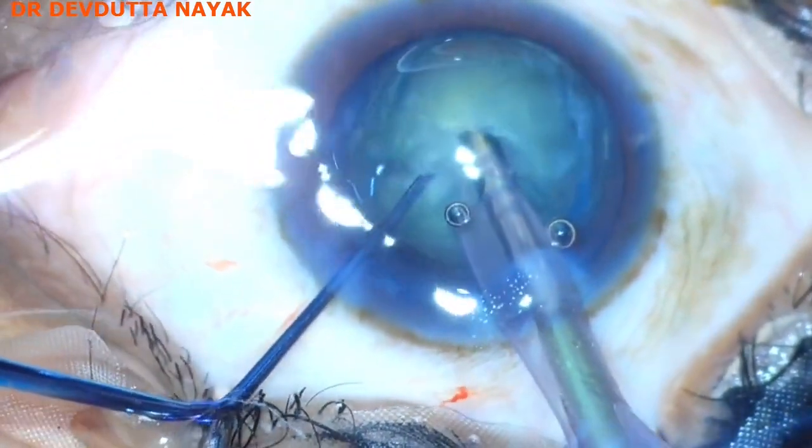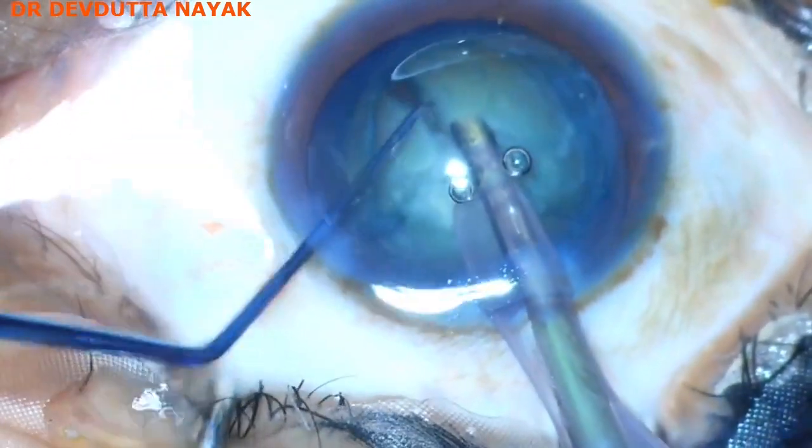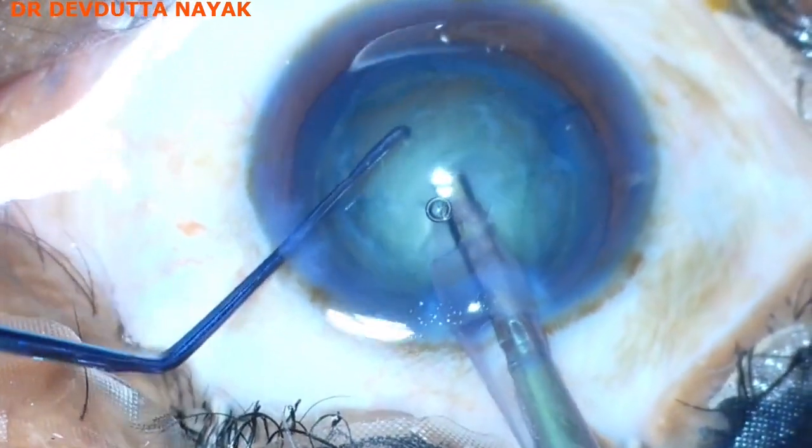We start off with vertical chopping. Multiple vertical chops are being done to fragment the nucleus.